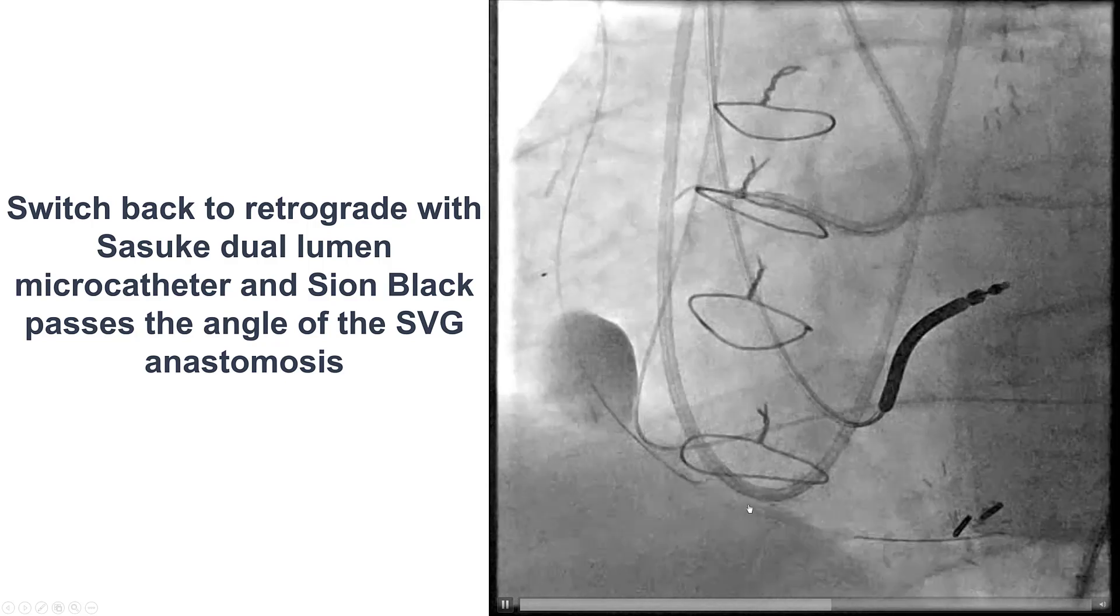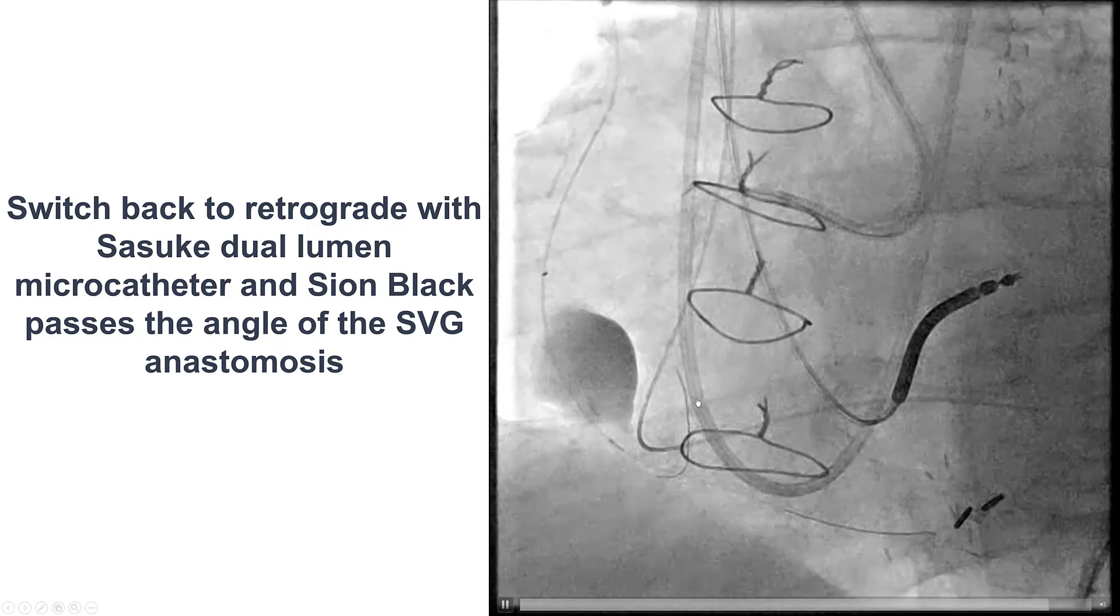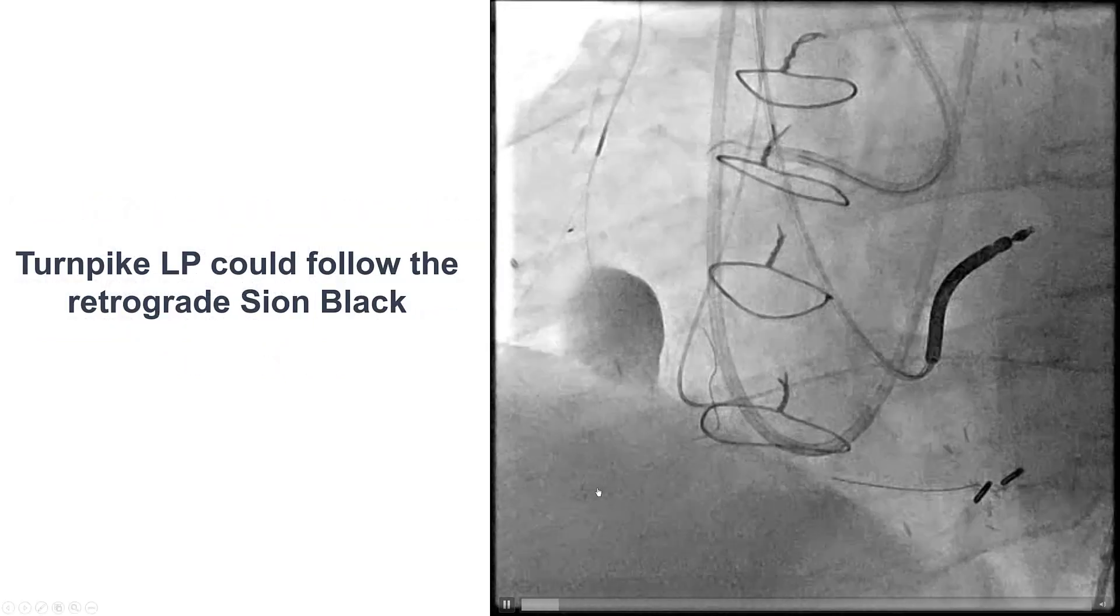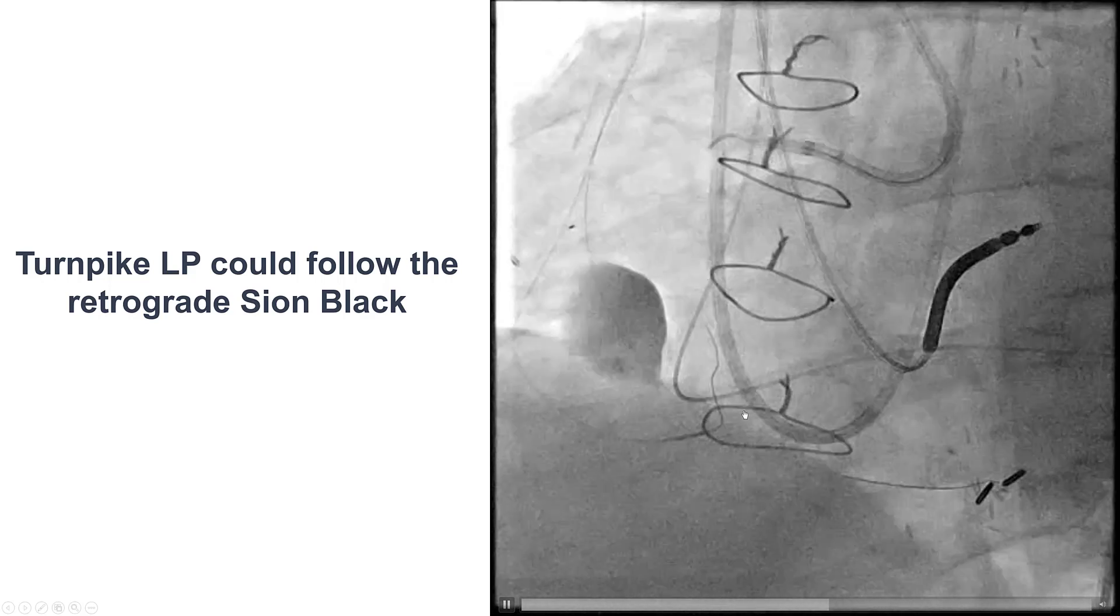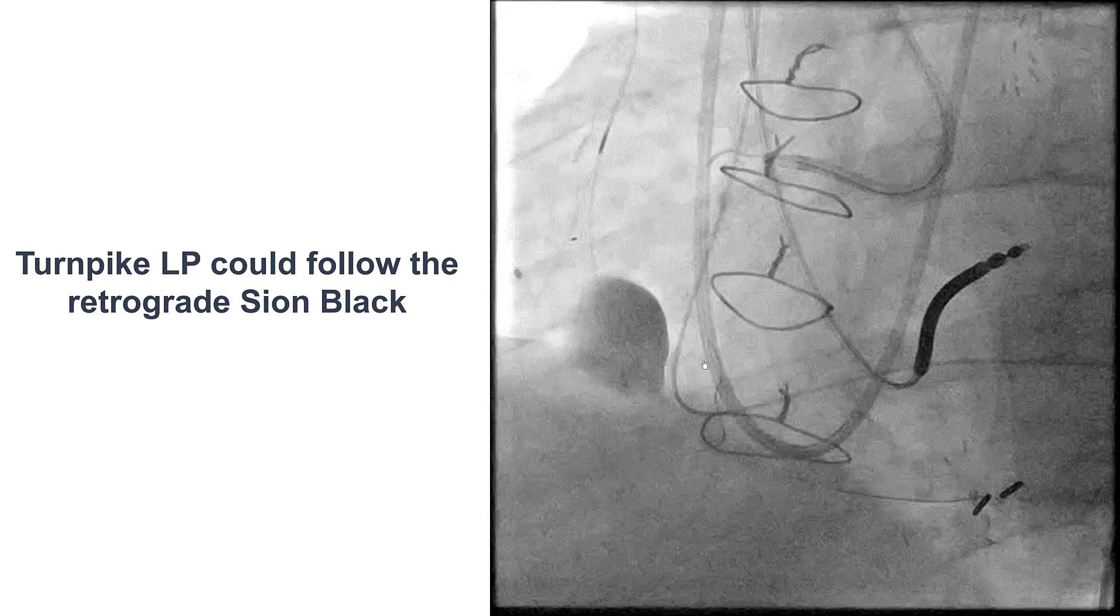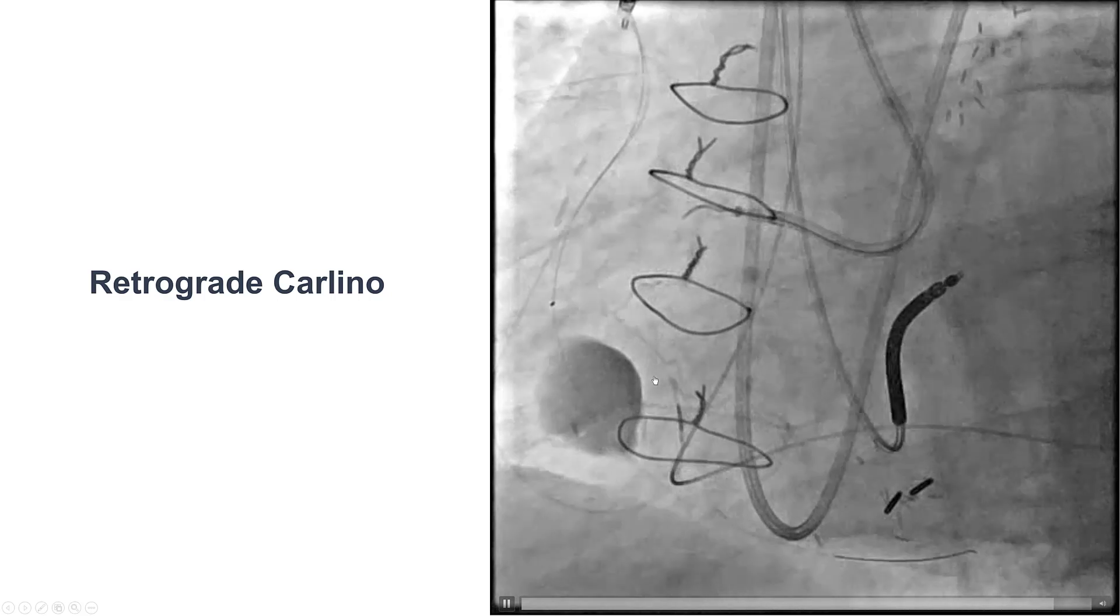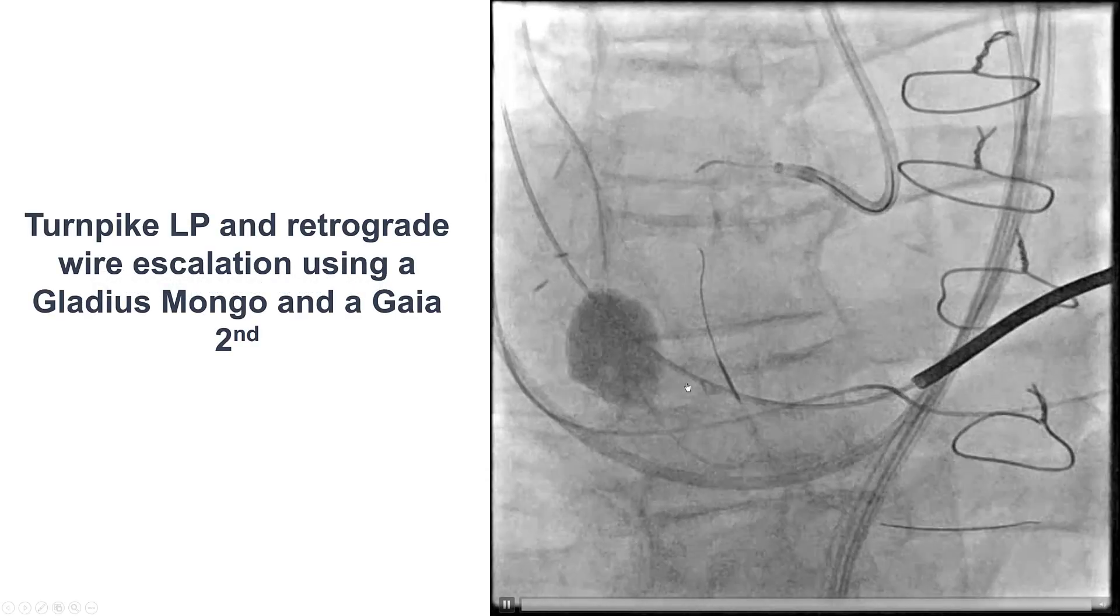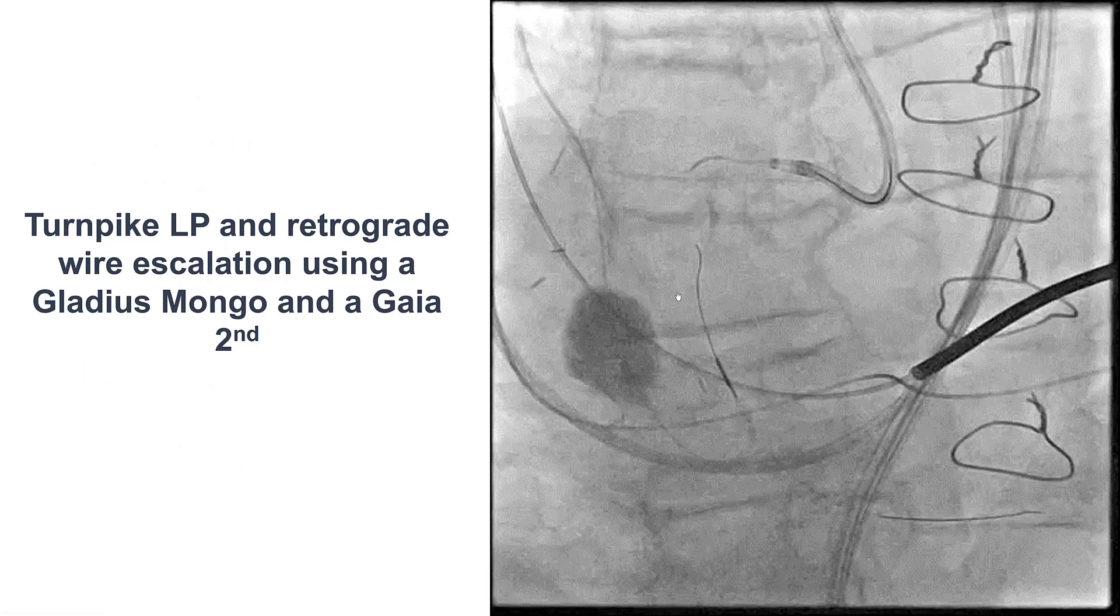We tried a Sasuke dual-lumen microcatheter that was advanced to the distal right coronary artery. And eventually, we were able to advance a Sion Black guide wire retrograde towards the distal to mid-right coronary artery. We were then able to advance a Turnpike LP microcatheter over the Sion Black into the distal right coronary artery, so that now provides us a much better chance for being able to cross retrograde. We did have a lot of resistance to advancing guide wires. We eventually did a Carlino, which is injection of a small amount of contrast through the microcatheter that was wedged within the plaque. And then used again a polymer-jacketed guide wire alternating with a Gaia second, and that seems to advance along the course of the right coronary artery.